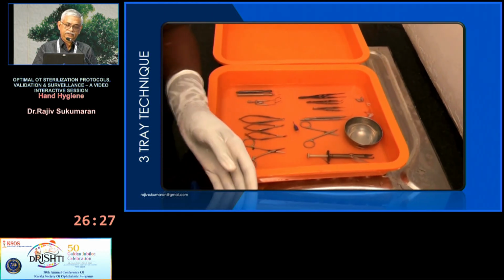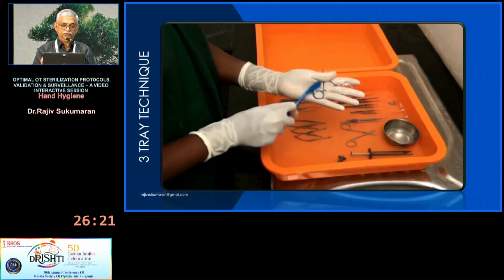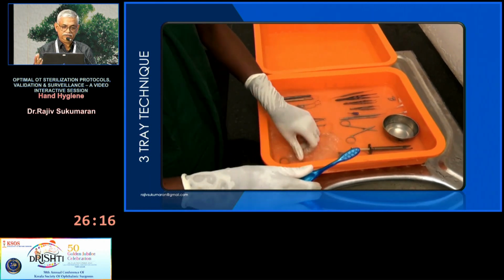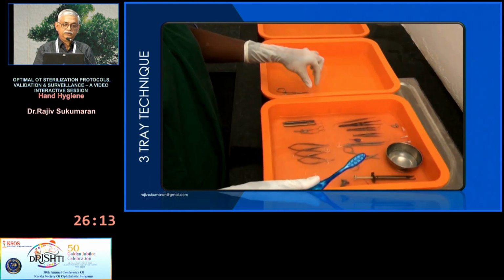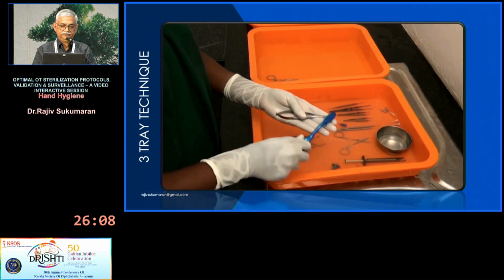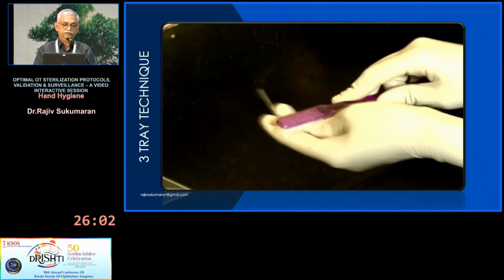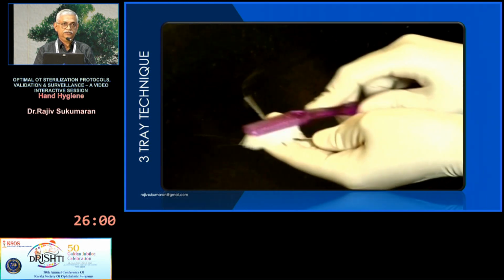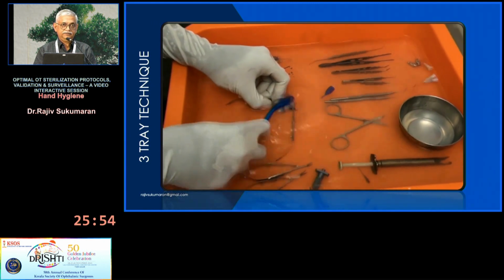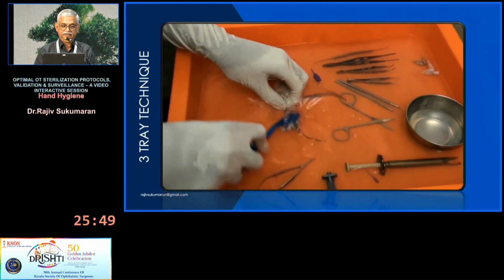After you soak it, use a soft toothbrush. And this is the wrong way of doing it. Don't do it outside the solution, because it's going to produce aerosolization, which is dangerous. It looks neat, but this is not the proper way of doing it. When you do like that, see that aerosolization, you're going to contaminate the entire area. So the ideal way is to clean it within the solution. That's the proper way of cleaning.